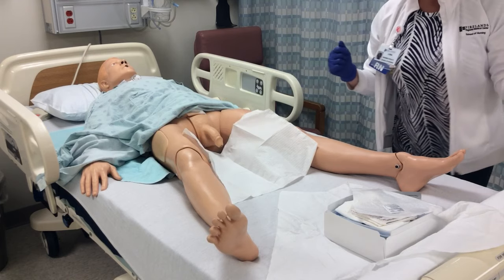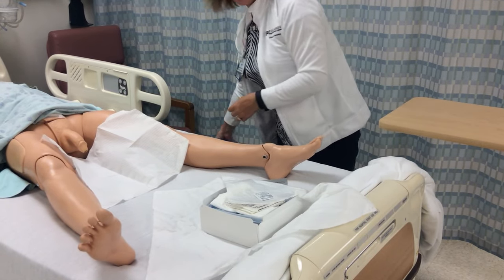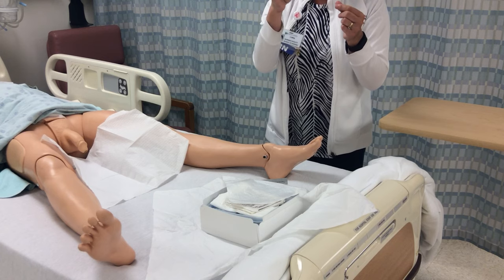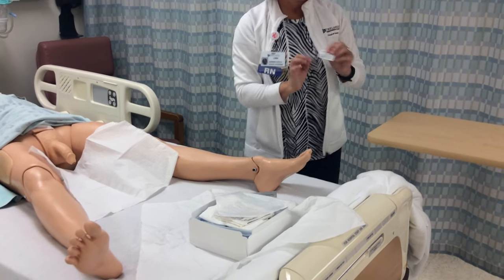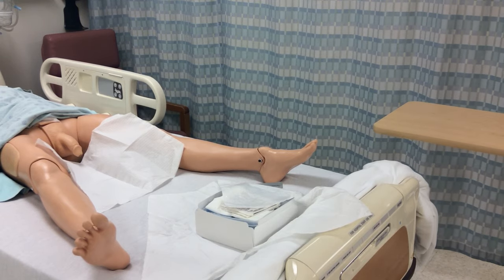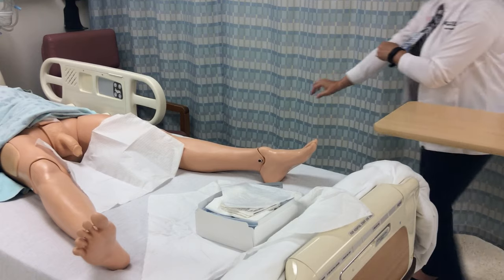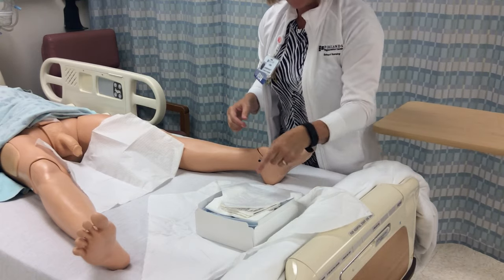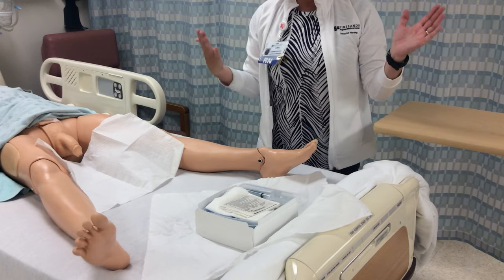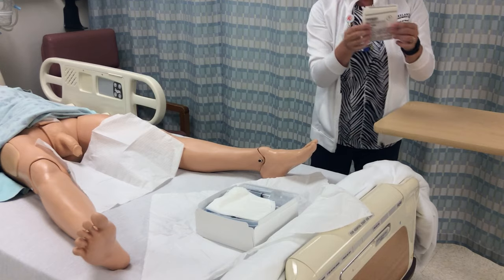Remove your gloves and perform hand hygiene with the Purell hand sanitizer wipes that are provided. Wipe your hands and discard, then open the last portion of the packaging, keeping everything sterile.